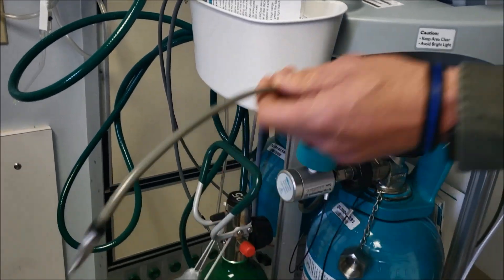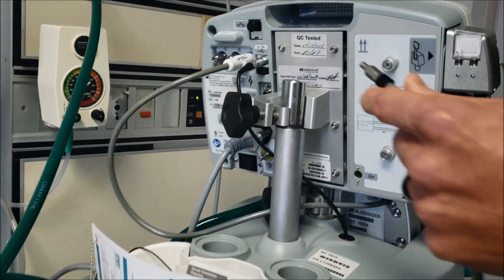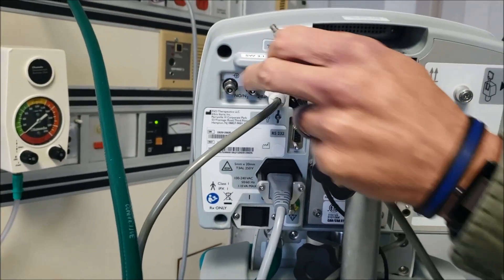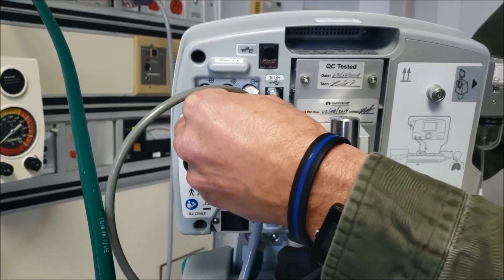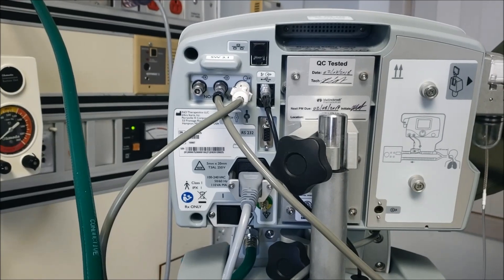And this gray hose that's attached to our regulator plugs into the back of the machine. Either one of these ports is okay. Either this one or this one. It doesn't matter which one. And that's going to be ready then to administer our gas.